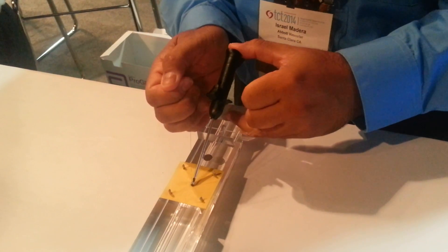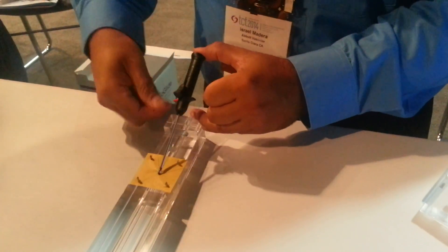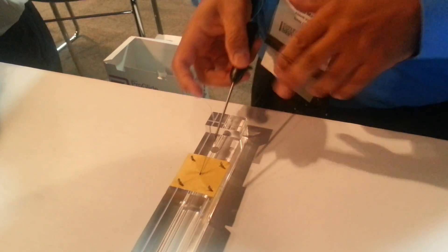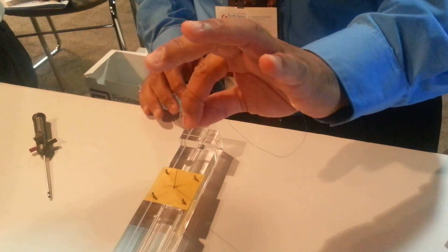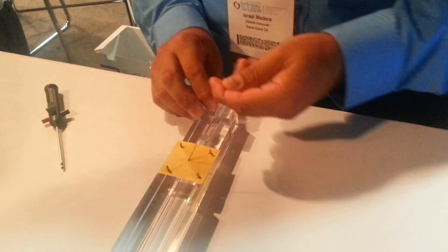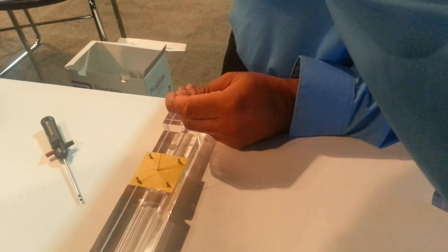Now I'm going to take my other hand and I'm going to pull. The other one also pull — coaxial, always coaxial. Once I take this out, I assess: do I have good hemostasis? Everything looks good. And I'm going to take both sutures and make them into one.